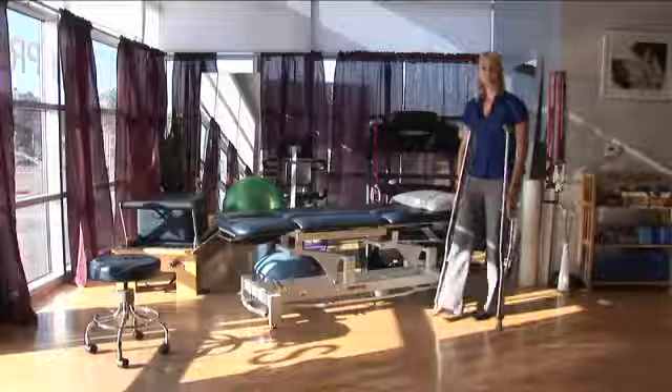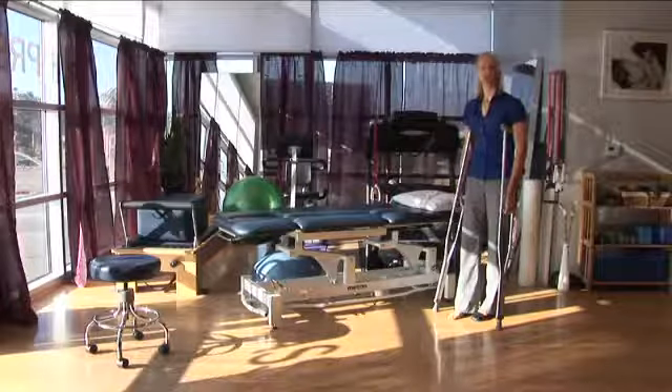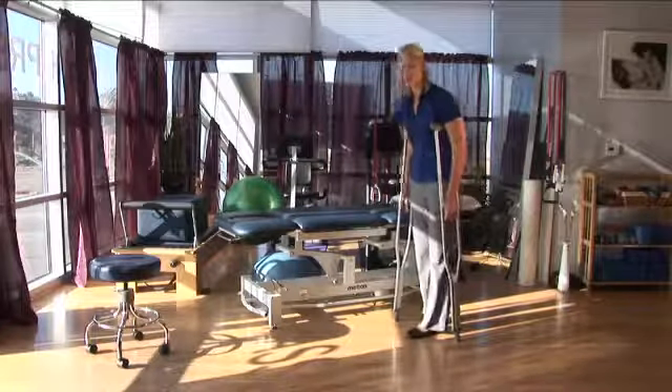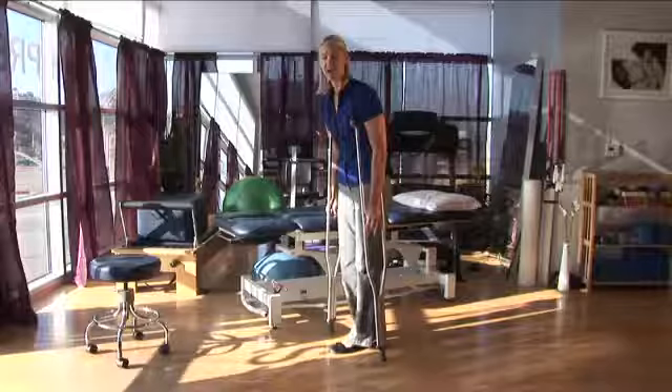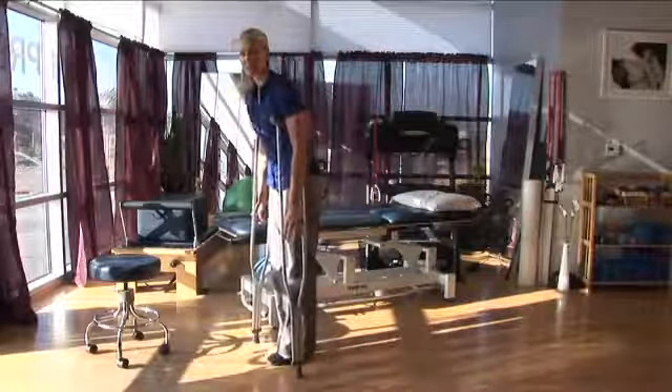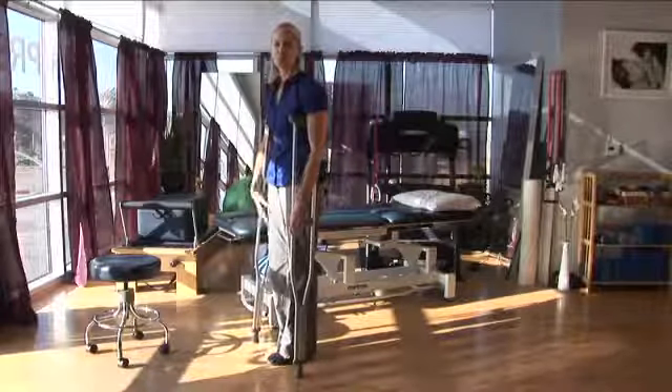So if I have sprained my right ankle, it's my right ankle that's going to follow the crutches. The crutches and my right ankle are going to go out at the same time. I'm going to push through the handles of the crutches to take a little bit of weight off of that ankle. So I'm just doing a step-two gait, just so I can take a little bit of weight off of that right side.